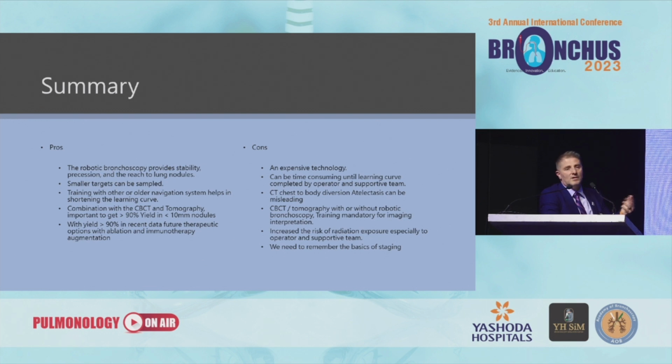There are cases where you don't have a bronchus sign, but we are also concerned at the same time with the radiation use for those cases. Also, we have to keep in mind that we have a double-edged sword in those cases.